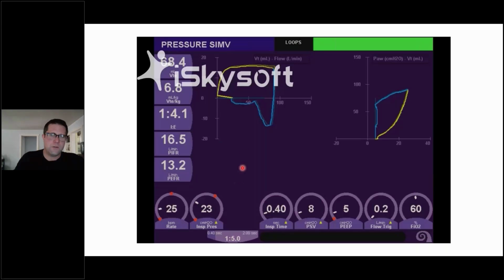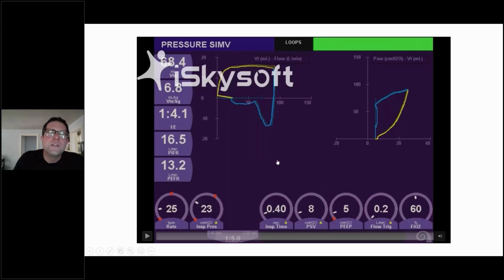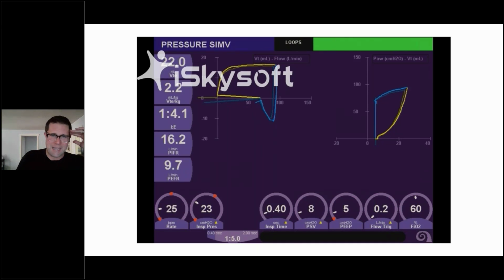So this is a video from back when we had our ventilators that shows a patient who had pretty significant tracheomalacia. You'd go in the room and they'd have these spells, and the patient at the time was on 5 of PEEP, and we'd see that the flow would go in on the flow volume loop, but then immediately after the peak flow, when pressure was reduced in the lung, you'd see this pretty significant collapse. And looking at the PV loop, there's quite a bit of distance between inhalation and exhalation, which typically indicates that the patient has high airway resistance.